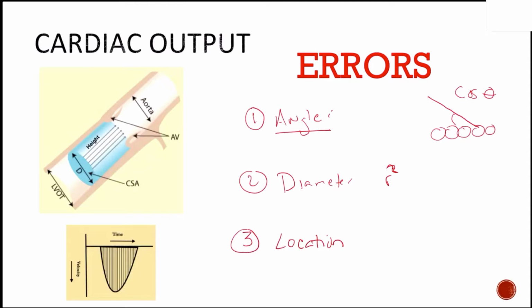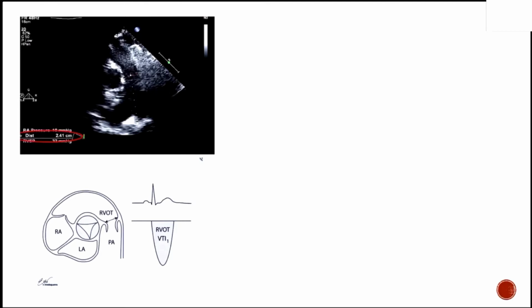Some people will say higher, 13% is kind of your magic number. So if you are measuring at different places where that left ventricular outflow tract is either wider or narrower, that's not going to give you a reliable calculation as to did this person's cardiac output improve with fluid. And so it's the same idea that you want to be measuring at the exact same place. Okay? All right. So we're going to move on.